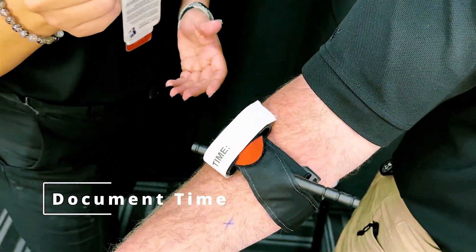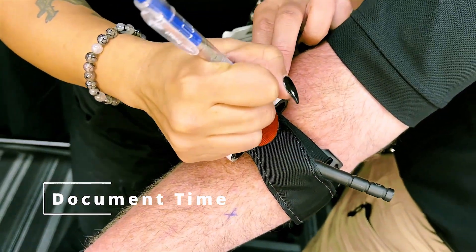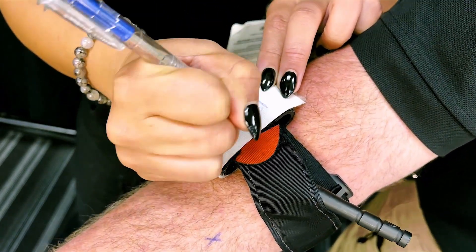Finally, document the time of application. The receiving hospital staff needs to know how long the tourniquet has been applied.